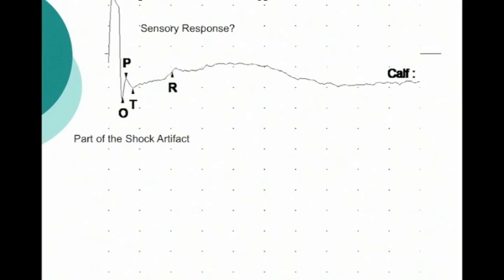Is that really the sensory potential? I bet it is. It's a bit delayed. It's in the beginning of the third column, but it's certainly not the one that it's measuring. So if we were to guess, the onset is probably here, the peak is probably here, and the trough is probably here. That's what I would take. The return obviously is very easy to guess.